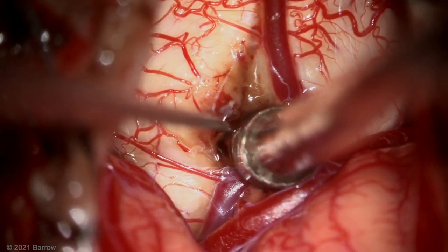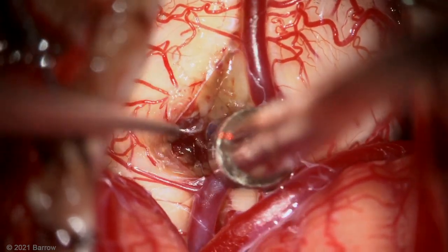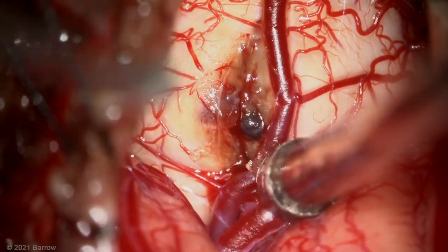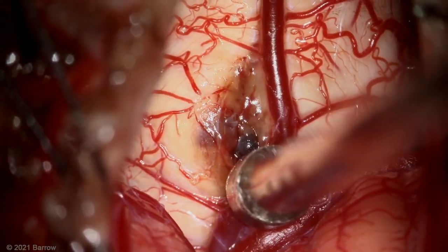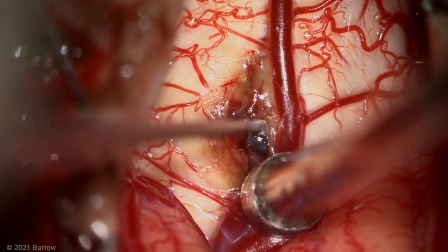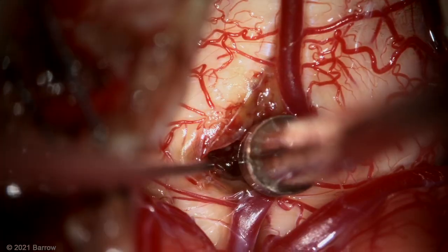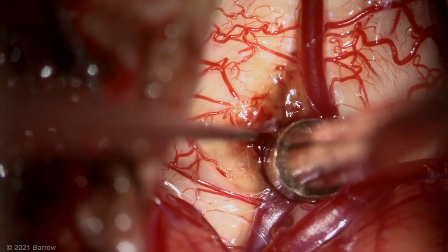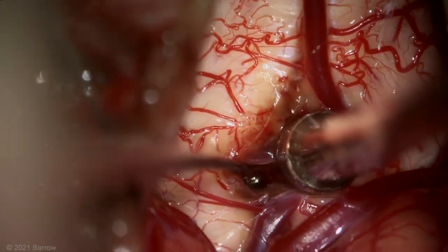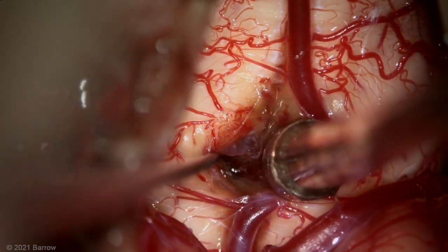Here are these nice delicate round knives, which sharply develop the plane of dissection between the capsule and the adjacent gliotic tissue. We go from one side to the other, from top to bottom, and slowly work this plane open between the malformation and the adjacent tissues.